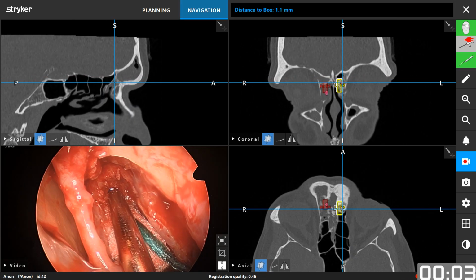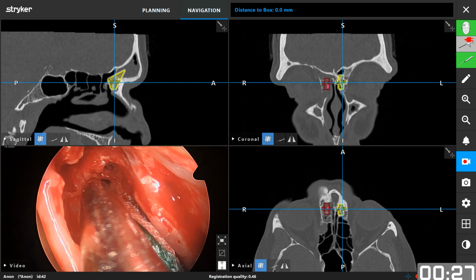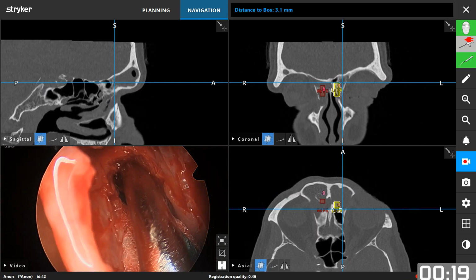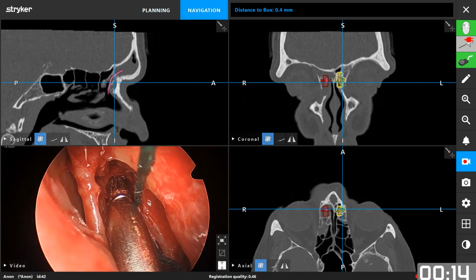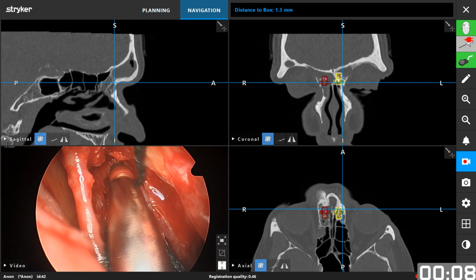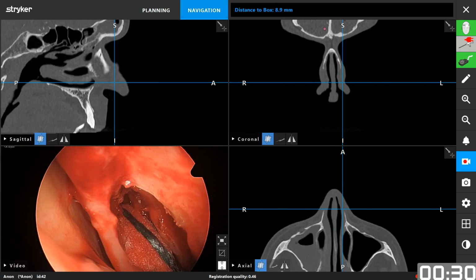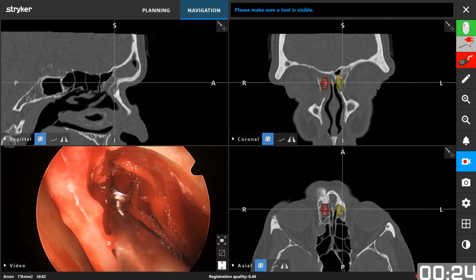So this is reaching the skull base in that area, so we need to drill more anteriorly again. So this is the frontal septum, frontal recess, and then there's a bone there that needs to be removed, which is the interfrontal cell. Yes, so I've opened the cell now, but still not inside the frontal sinus.